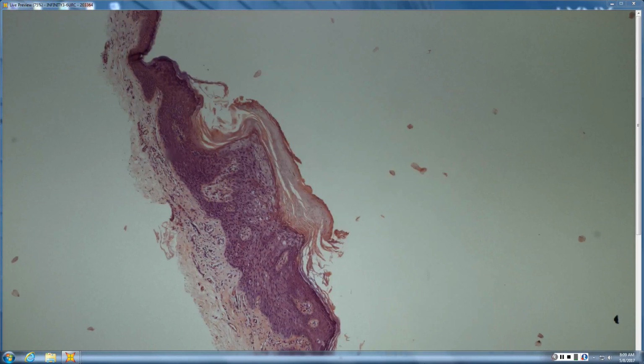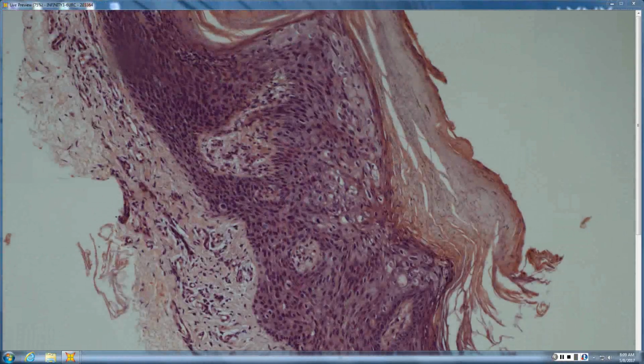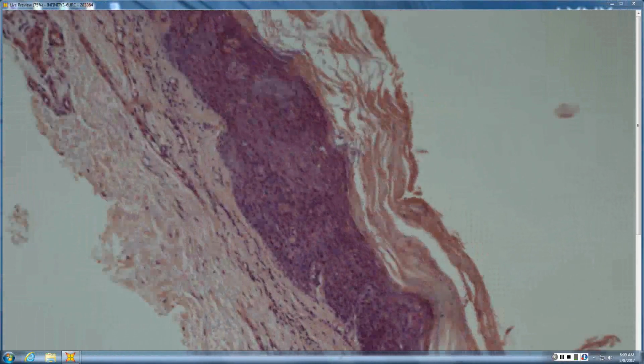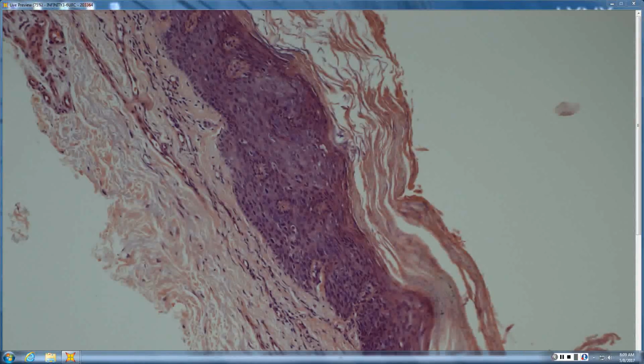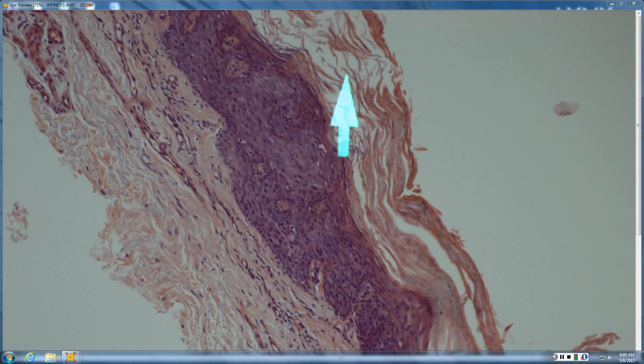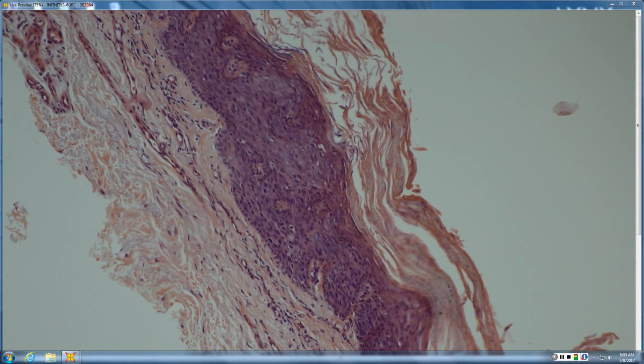See, epidermis primarily involved. Crusty, atypical cells in there. Very good. Is it just an AK or something? Yeah, there's certainly a suggestion of clonality where you have some normal epidermis, and that goes more with Bowen's. But you're absolutely right. You know, Bowenoid AK versus Bowen's.